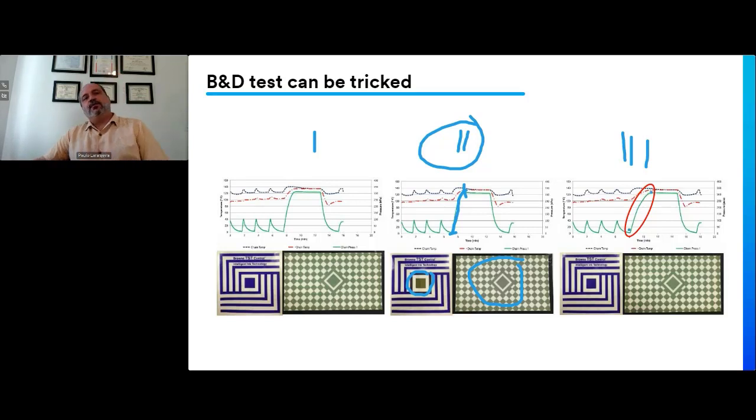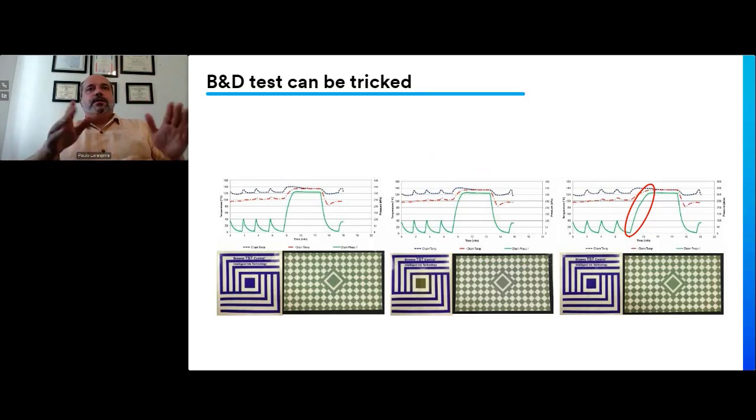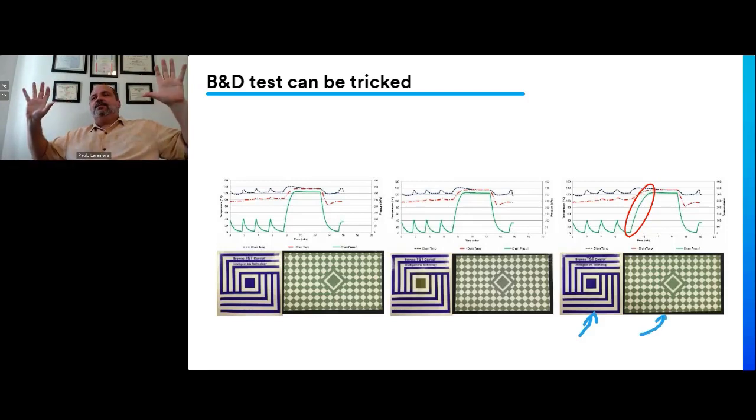If you compare the graph in the middle to the one on the right, you're going to see that the curve on the right is a little bit inclined. So it shows that it took a longer time to reach the exposure phase. Because of the excessive exposure to temperature, my chemical indicator on both Bowie-Dicks changed color, even though we had air, and I'm going to show you in the slide in a little bit how air is trapped inside of the Bowie-Dick. Even though we had air inside of the chamber, because of the excessive temperature, these chemical indicators react to temperature. Because of the excessive time and temperature, the color of the Bowie-Dick changes even in the presence of air.